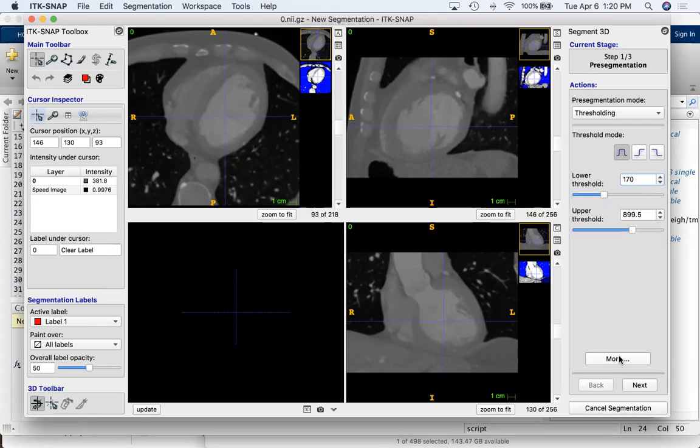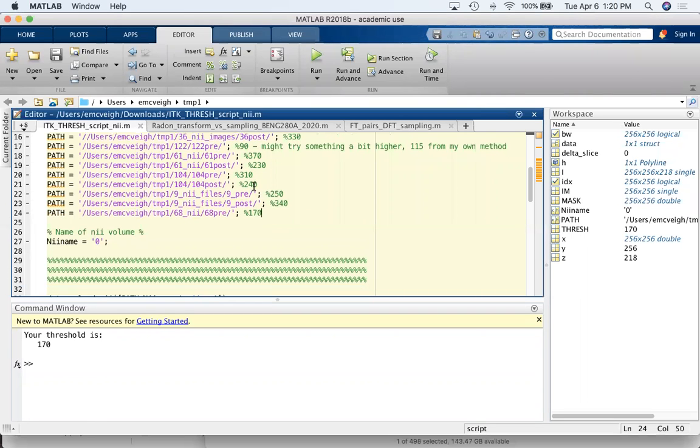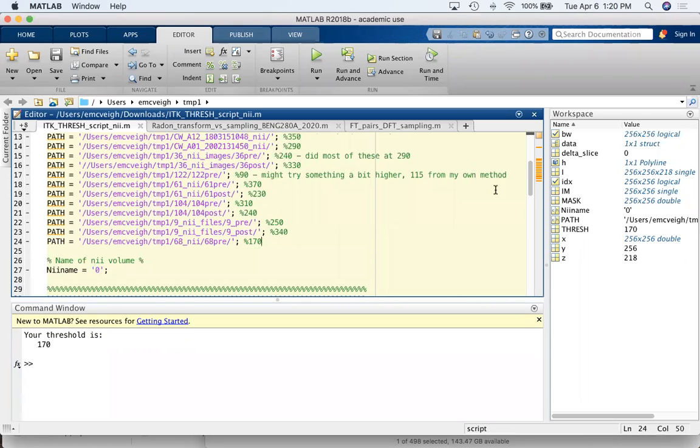So do you have this MATLAB file? No, I don't have that. Do you have MATLAB on your computer? Yes, but I will do it later. I will just set something similar. I was just wondering what you had. Yeah, I think 170 could kind of do for my case. The myocardium is around 140 and things like that, and the blood is 300-something. That is like your case.